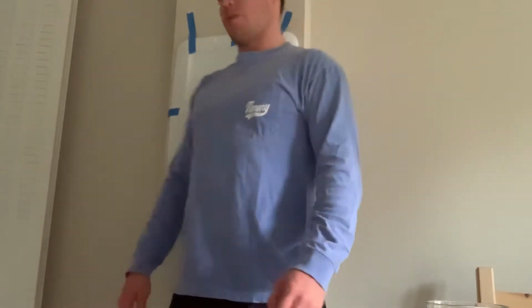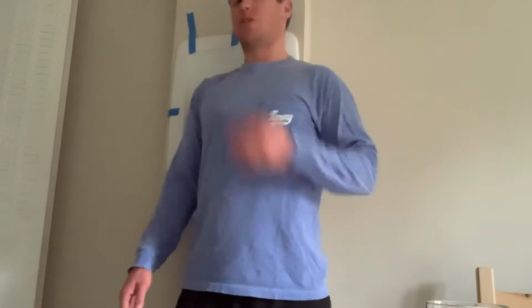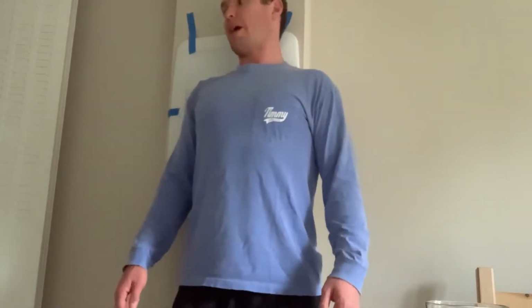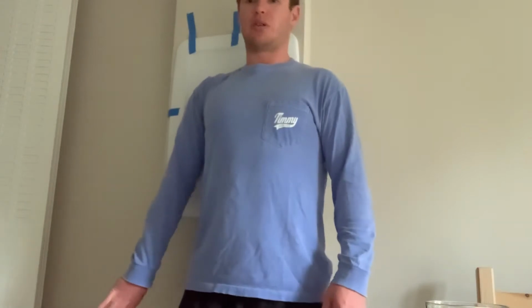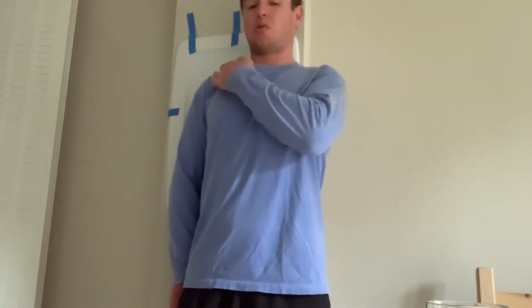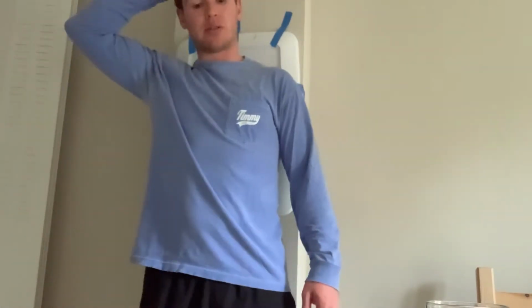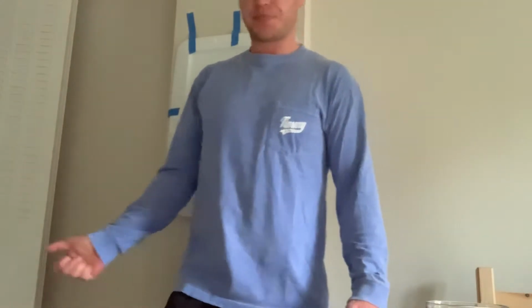So to start, we'll be doing the A to P internal rotation. So the patients will be standing with their back up against the cassette. Their arm will be internally rotated with the back of the hand resting against the thigh. Our central ray will be directed through the coracoid process, and this will give us a view of the greater and lesser tuberosities, the glenoid fossa, and the scapula.